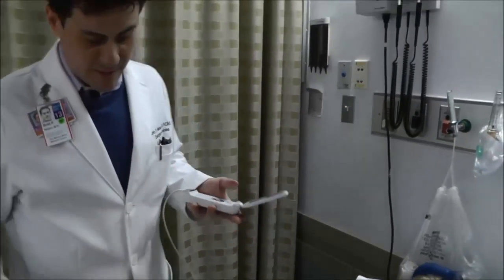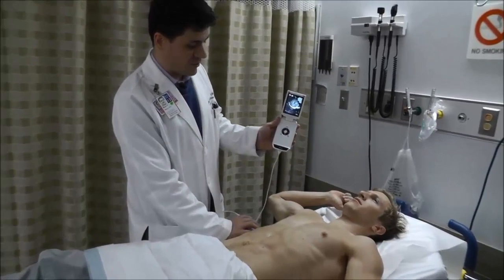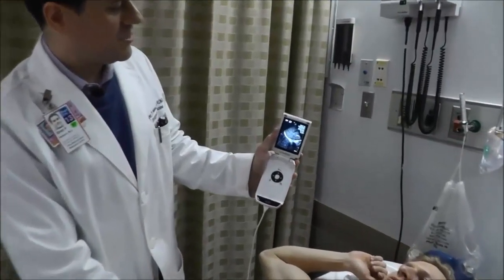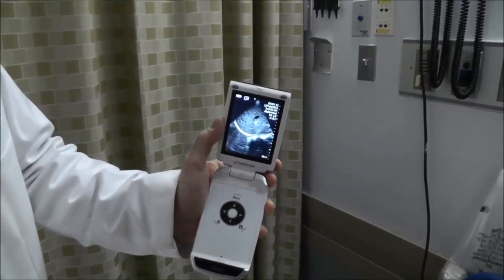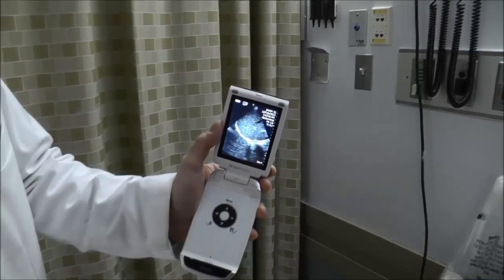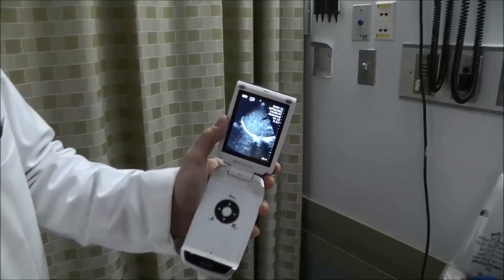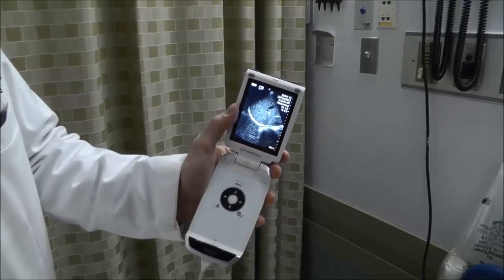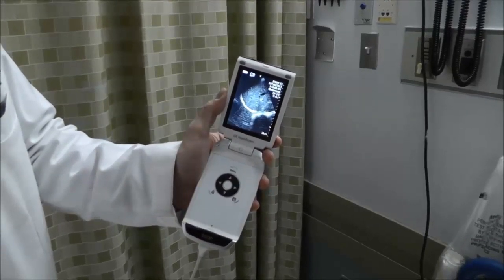Similarly, we move to the right side, which is going to be a bit more anterior. Here we're looking at the liver in the near field, and we see the diaphragm underneath. Below that we actually see a reflection of the liver known as a mirror image artifact, which can appear as a gray, nondistinct structure. As long as you're not seeing black, crisp fluid above the diaphragm, there is no pleural effusion.